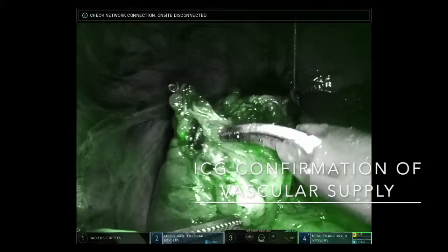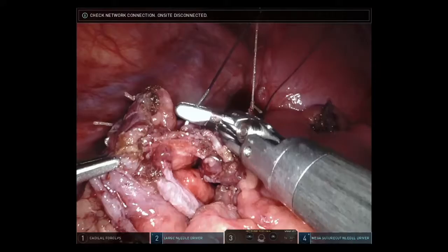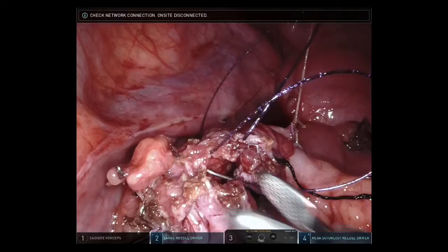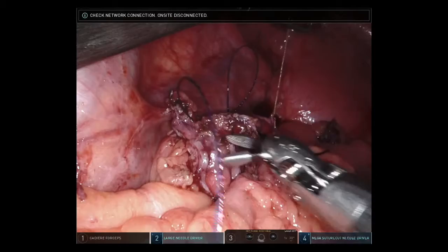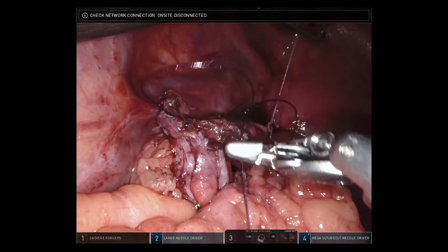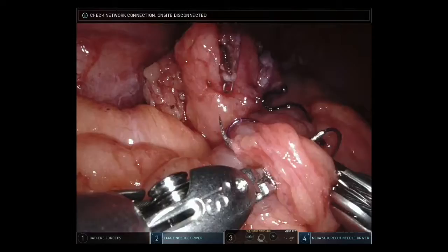Three mLs of ICG are injected to confirm the vascular supply in firefly mode. A 2-0 barbed monofilament suture is used to close the common enterotomy. This particular suture has an eyelet through which the needle can pass to lock the suture into place. The barbed suture is preferable when sewing robotically as it allows us to avoid knot tying in the tight space. The suture is run from left to right and then from right to left, essentially creating a double layer closure of the common enterotomy.